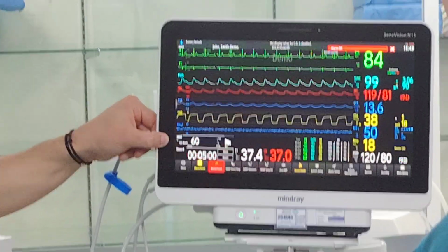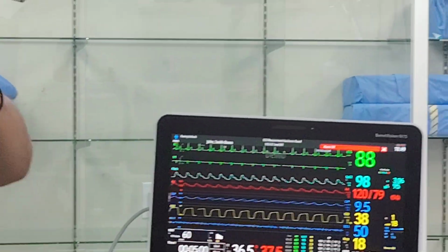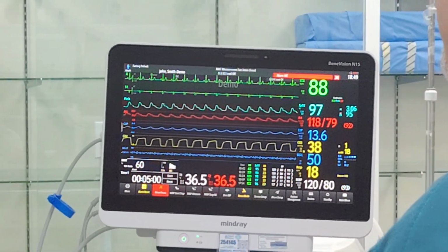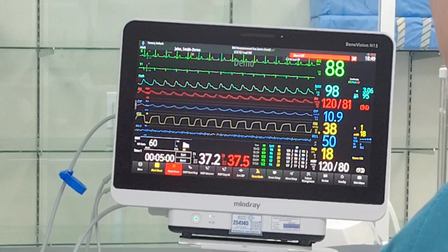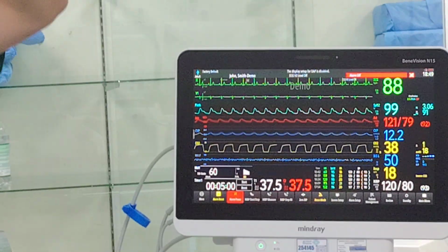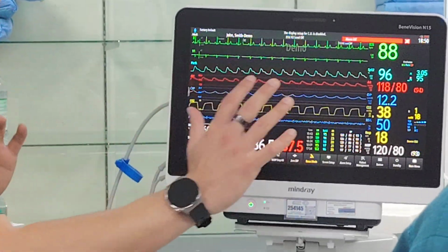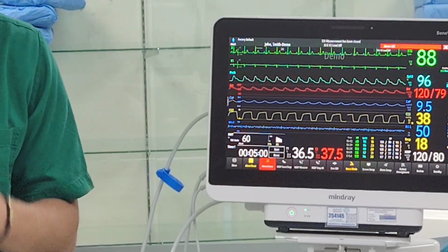Once everything has dropped, it will no longer see any strength in the current. It will count how many times the hand moved, not the strength of the movement. So here you will have it as count. It will go 4, 3, 2, 1, and 0. In the TOF, it's always giving 4 pulses. Pop, pop, pop, pop, you hear t, t, t, t.